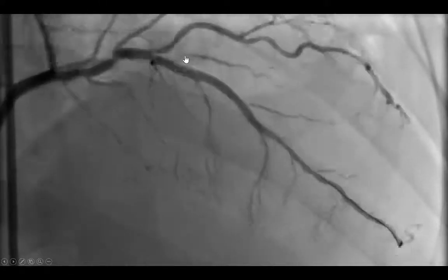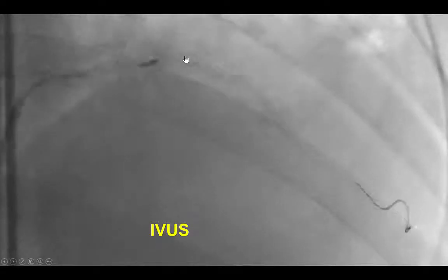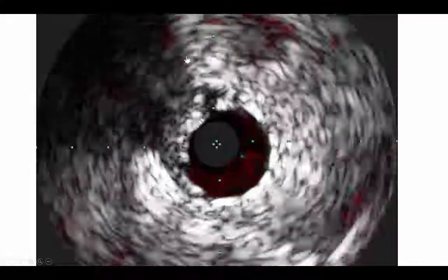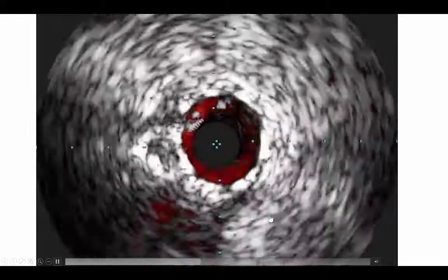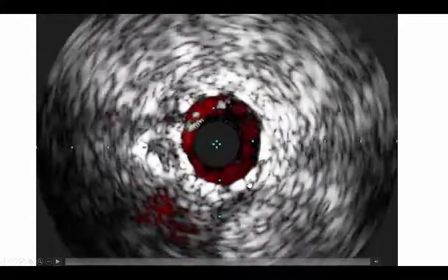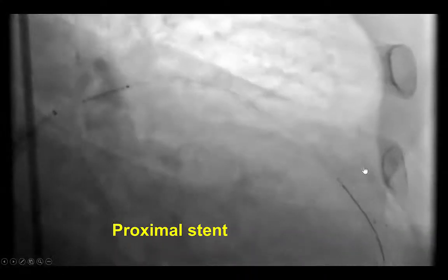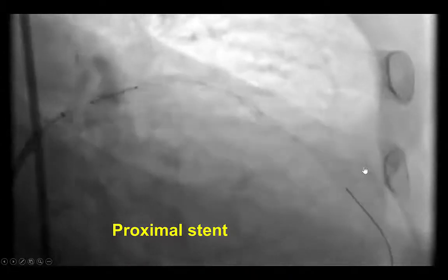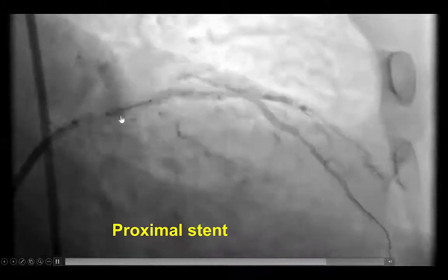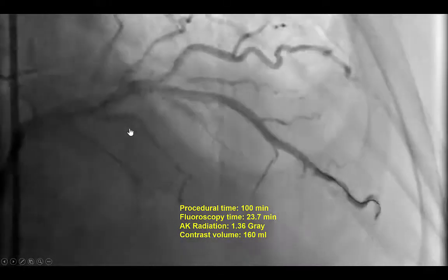The stent appeared satisfactory; however, in heavily calcified vessels like this one, what appears good may not always be. That is why we performed intravascular ultrasound, which demonstrated good expansion in the distal part of the stent but clearly showed significant stent under-expansion in the most proximal segment. There was also additional disease even more proximal in the vessel. We therefore performed high-pressure post-dilations that significantly improved the stent diameter, and given the additional proximal LAD lesion, we placed another stent into the proximal LAD.